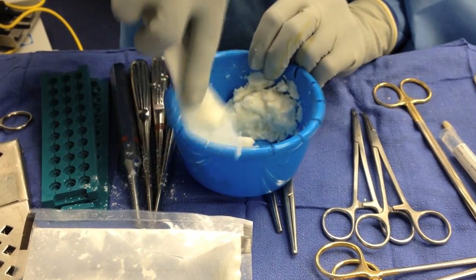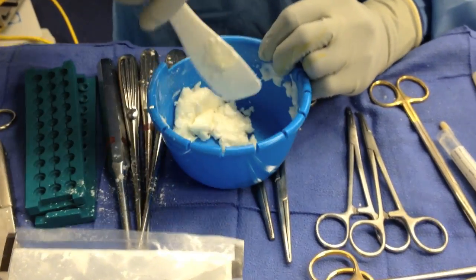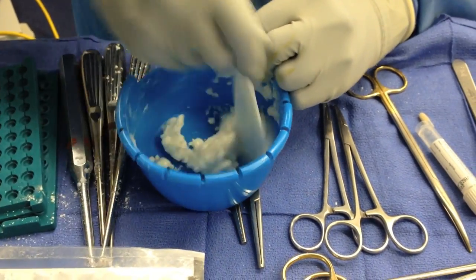You'll also notice we're mixing by hand. The reason we're doing this is that it increases the porosity of the cement and helps the elution characteristics. The elution characteristics are also helped by using 2 antibiotics instead of 1.